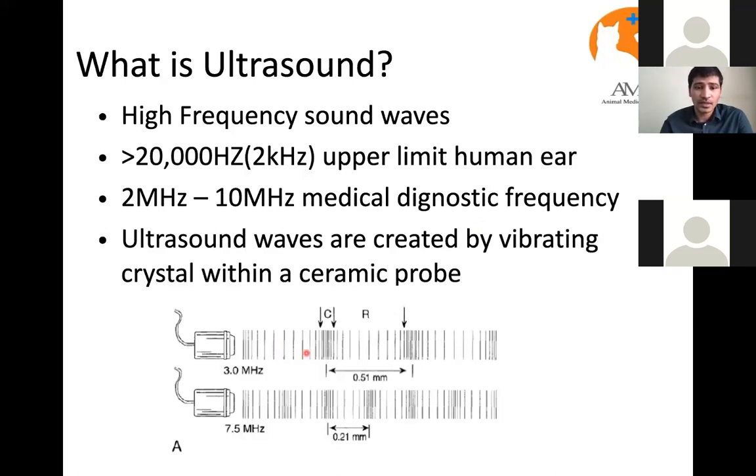Here you can see the wavelength of the 3 megahertz sound wave, and this is 7.5. You can see the difference, how it travels.